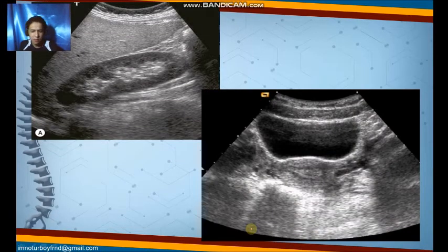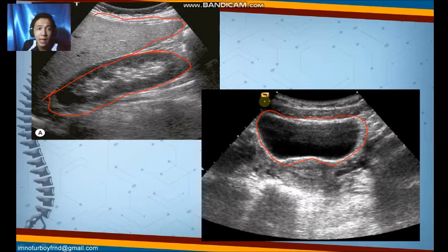So just example images. Now we have here the liver, no? The liver, and then the kidney. And in this image, we also have here the urinary bladder. So as mentioned yesterday, we have discussed topics about the artifacts related to ultrasound. So as you can see in these images, these are productions of artifacts.